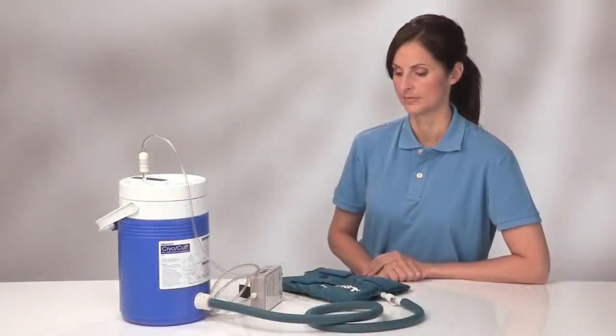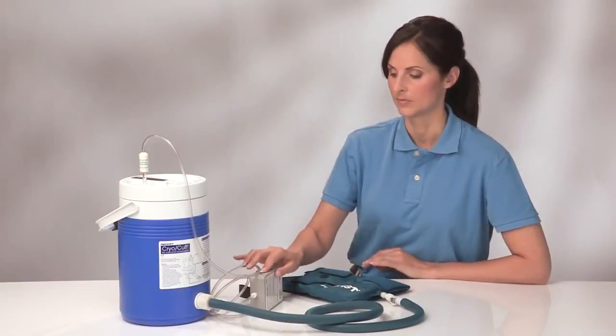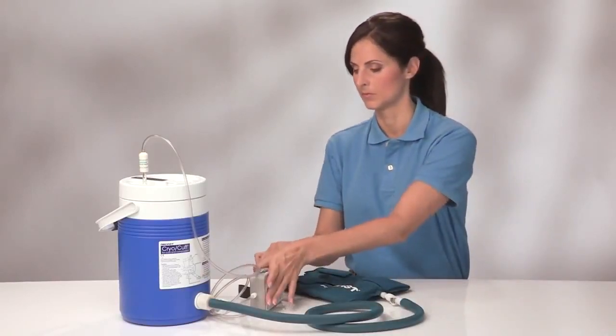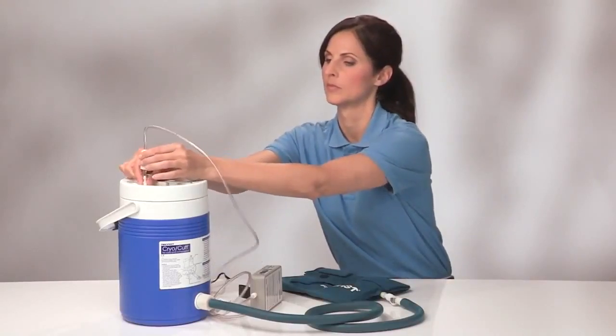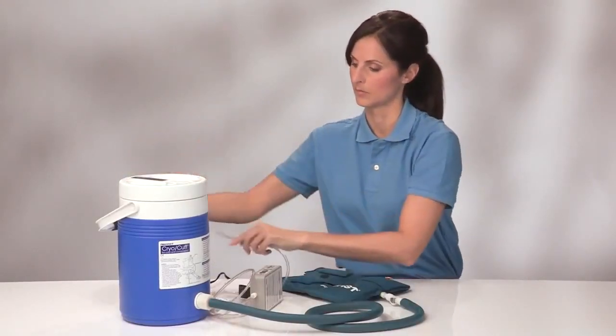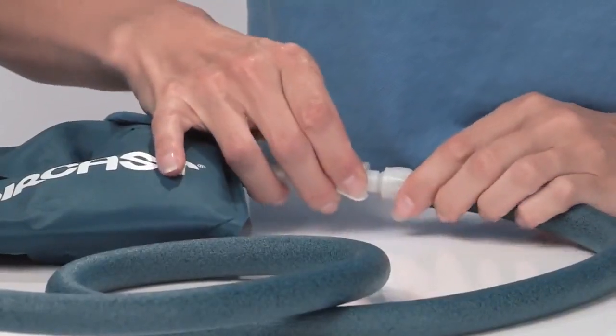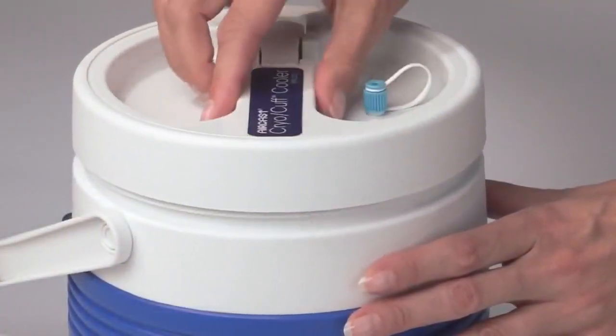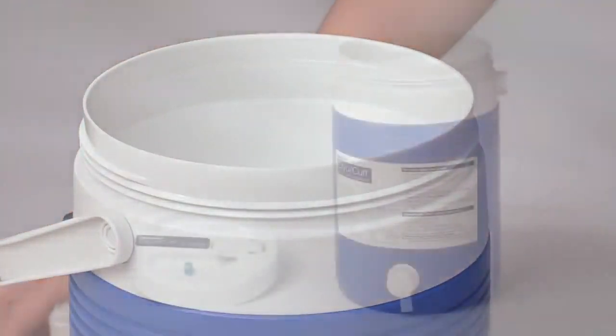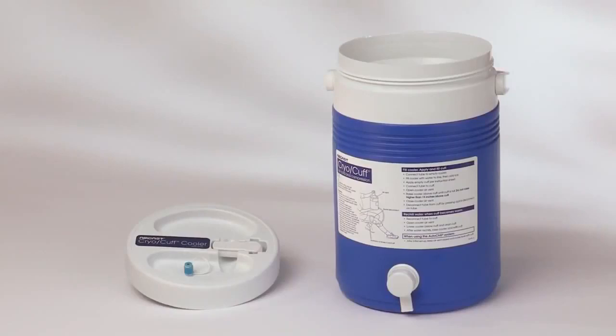To replace the ice when using the auto-chill, turn off the pump and unplug the wall adapter. Disconnect the clear air tube from the cooler and disconnect the blue tube from the cryo-cuff by pressing the metal tab on the quick disconnect. Open the cooler and pour out the water. Now you are ready to refill, pressurize, position, and reconnect as you have previously.